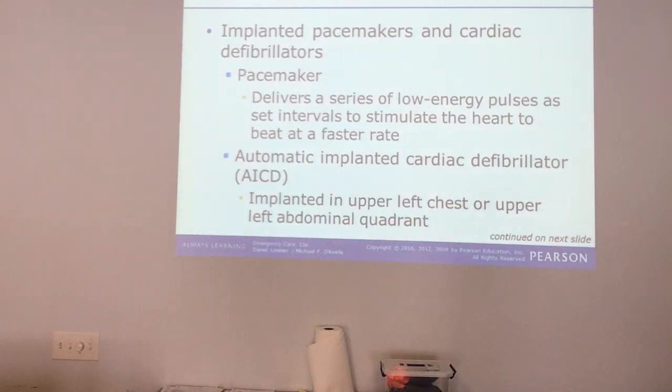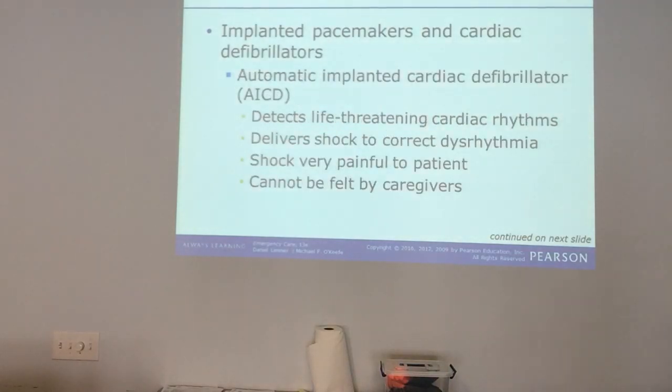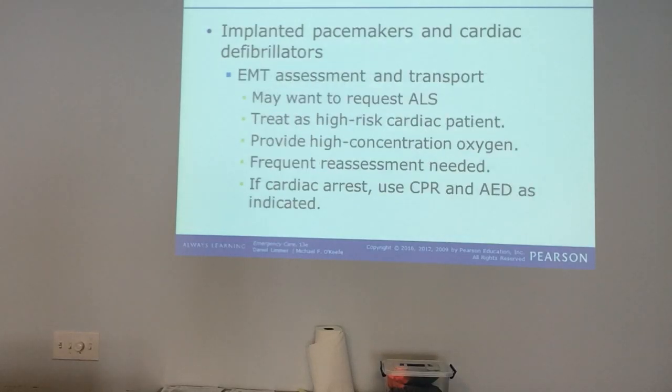Automatic implanted cardiac defibrillator, implanted in the upper left chest or upper left abdominal quadrant. It detects life-threatening cardiac rhythms and delivers a shock to correct the dysrhythmia. The shock can be very painful, but cannot be felt by caregivers.